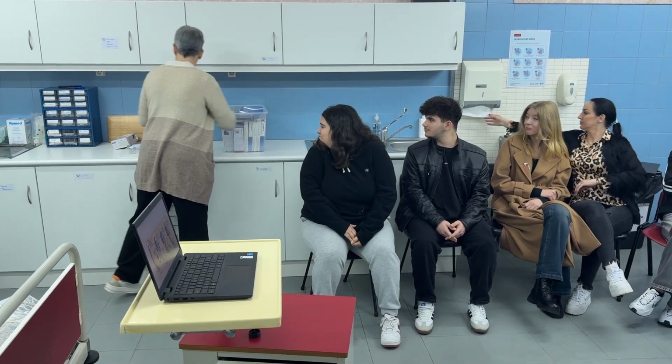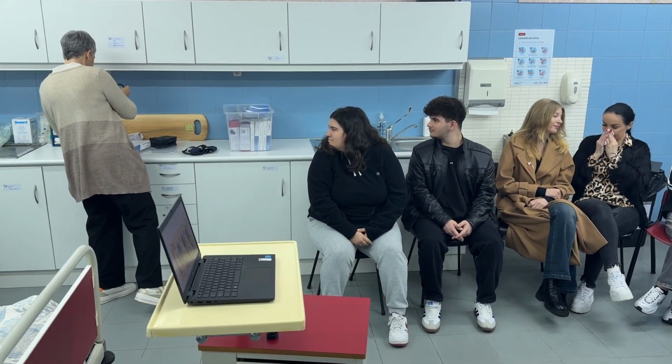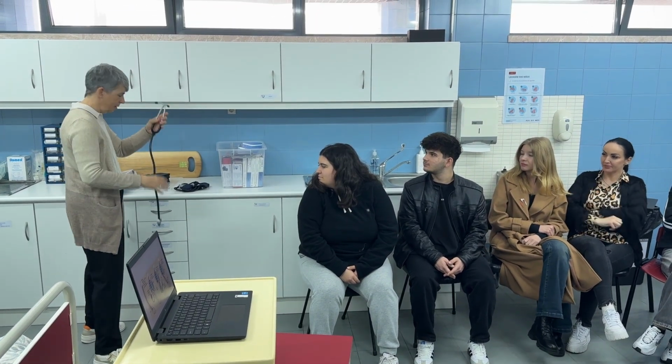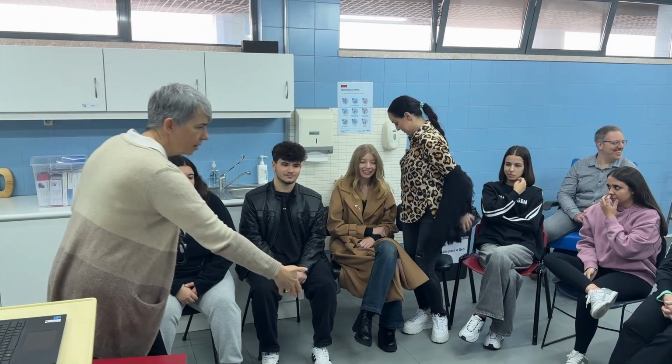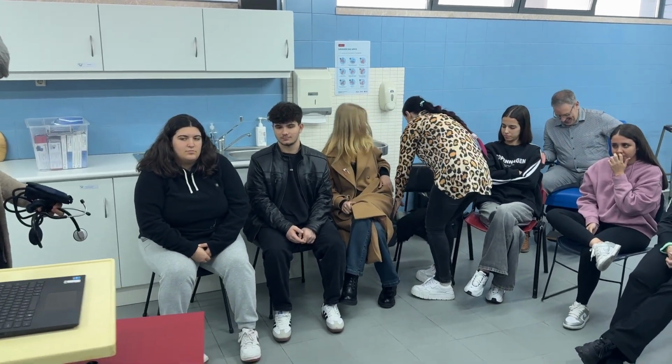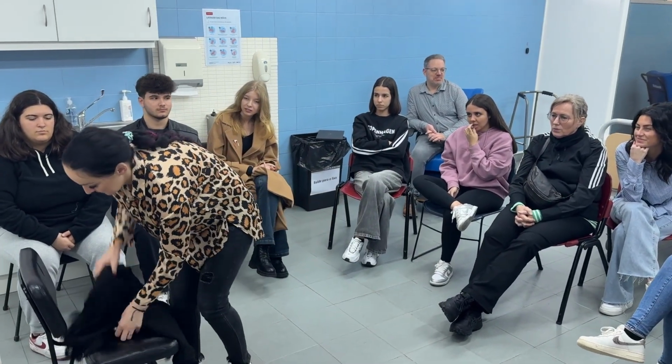Here we have really brand new, very nice equipment that they arranged for us. The stethoscope and the... who would like to demonstrate? Because you're already very much specialized. Who would like to be the patient? So you can take your chair and sit here a little in the middle, so that everybody can see you. And then somebody else can take the pressure. Then I can comment a little bit. Who wants to do it?